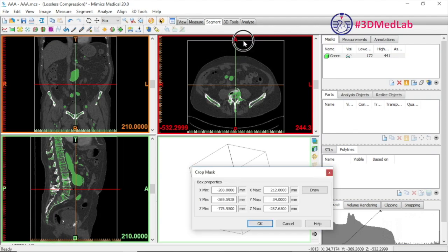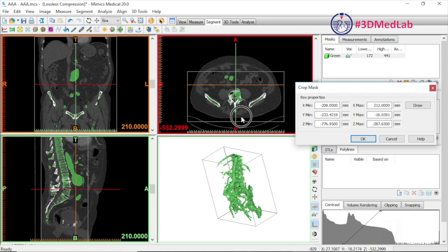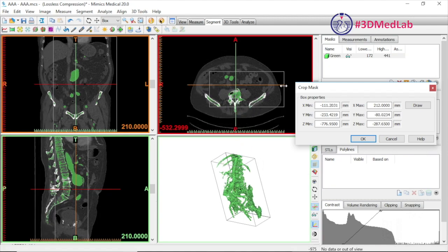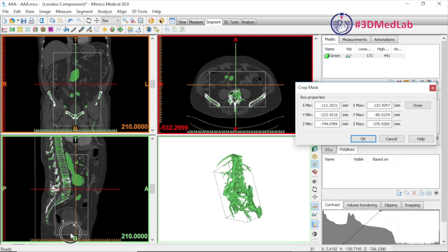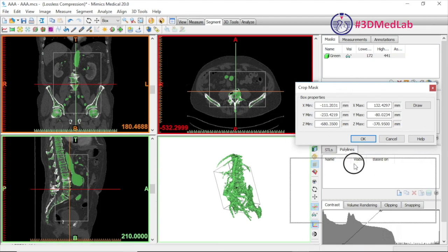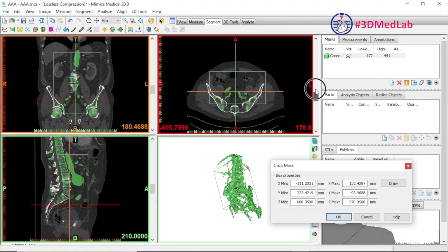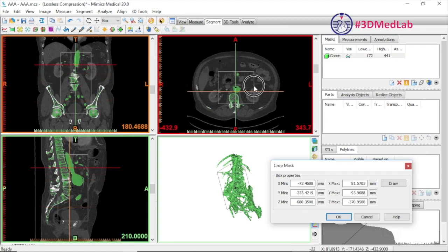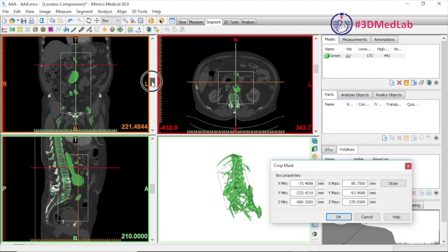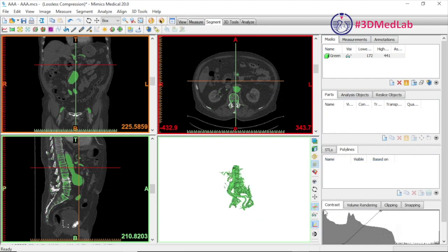Next we'll crop the region of interest so we only capture the area needed for aneurysm planning. Generally we want a region from above the renal arteries down to the femoral bifurcation. We don't need any tissue anterior or posterior to the aneurysm, and we don't need to capture the kidneys, so we'll remove those using the crop function demonstrated here.